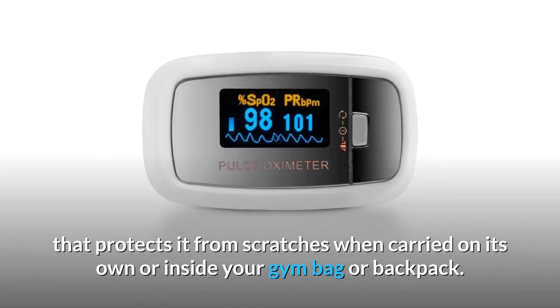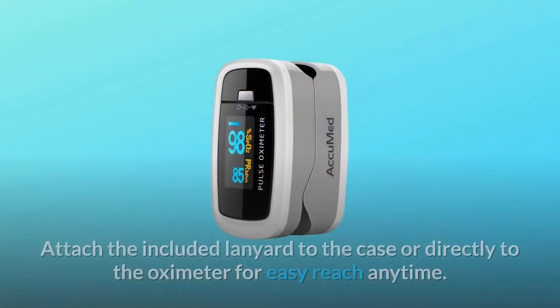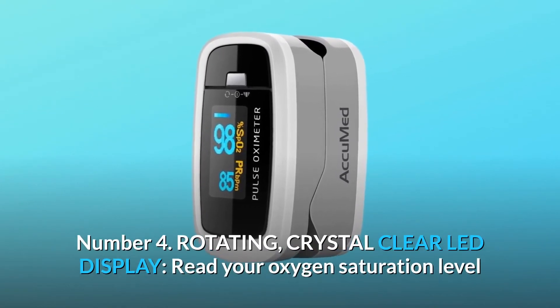Number three: portable and lightweight. Weighing only 50 grams, every AccuMed oximeter comes in a convenient travel case that protects it from scratches when carried on its own or inside your gym bag or backpack. Attach the included lanyard to the case or directly to the oximeter for easy reach anytime.